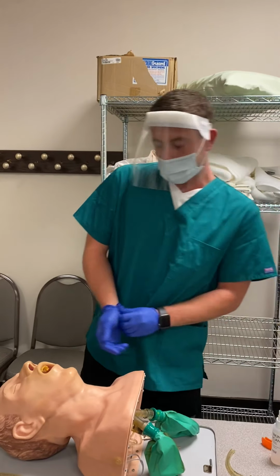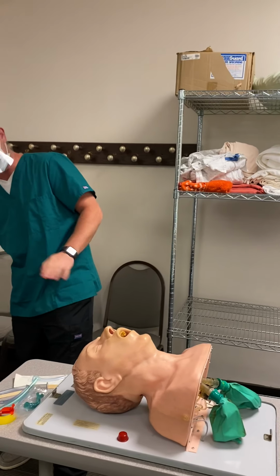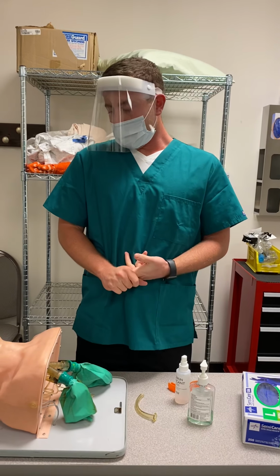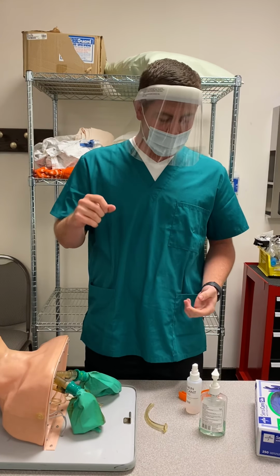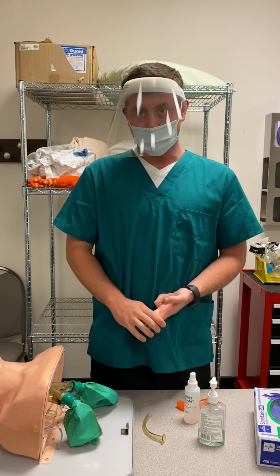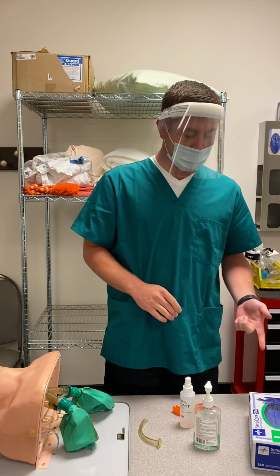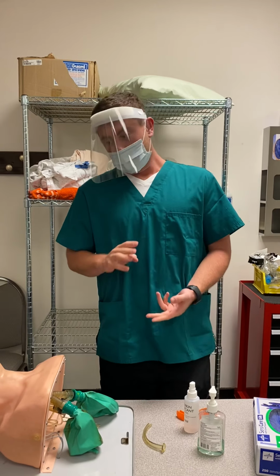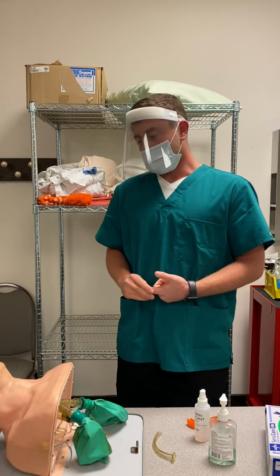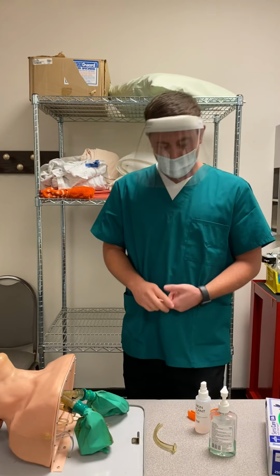Now, onto the nasopharyngeal airway, I apologize. I would then start by gathering equipment, which is the nasopharyngeal airway and the lubricant, as well as the hand sanitizer and rubber gloves. And as I go into the patient's room, I would review the chart and ensure that the doctor ordered the nasopharyngeal airway.